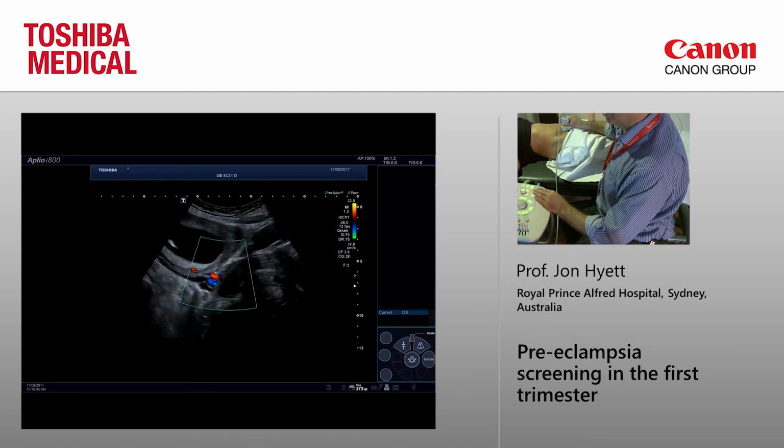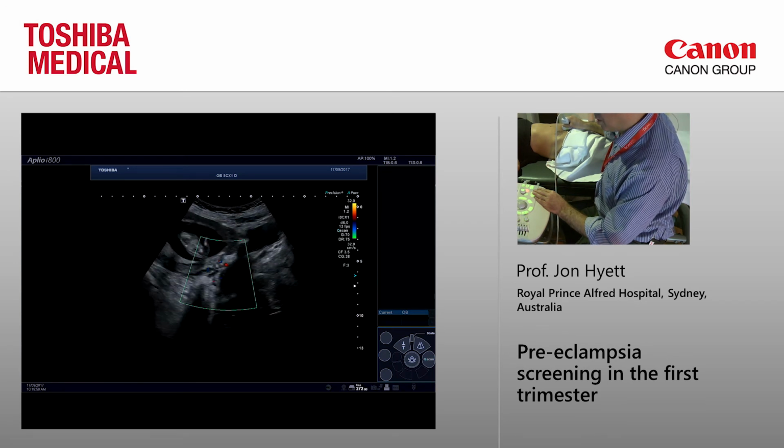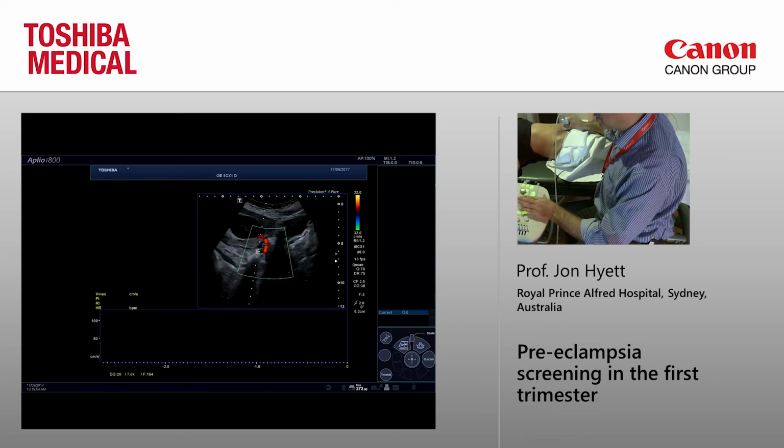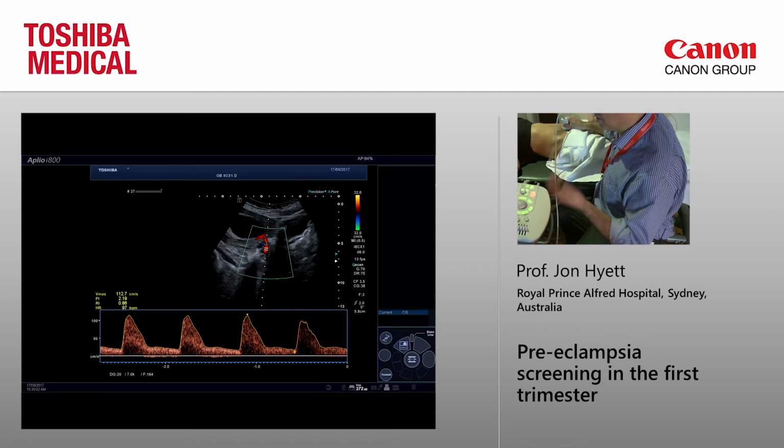So this was the uterine artery on this side. If I just sweep across the cervix, we can find the vessel on the other side here. So I think that's a much better demonstration of where we're at typically in terms of ease.